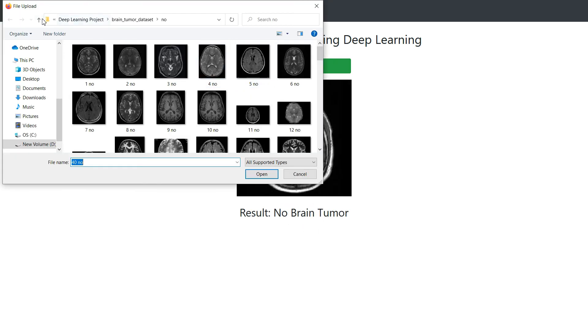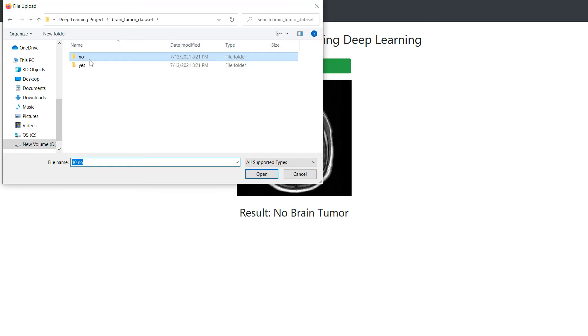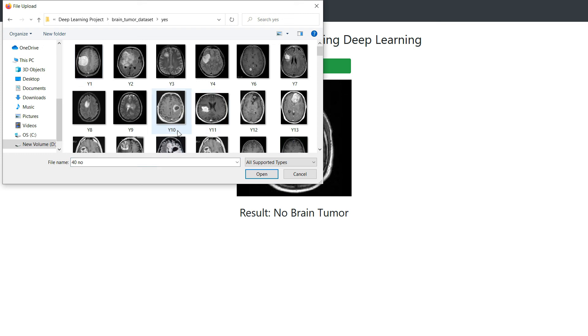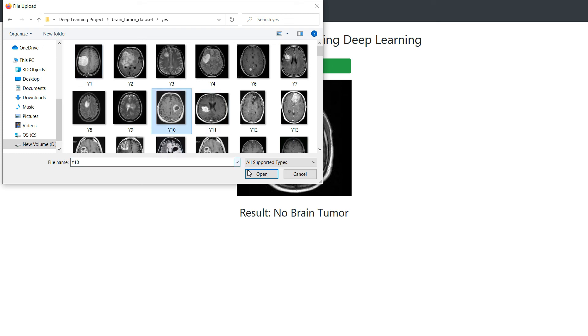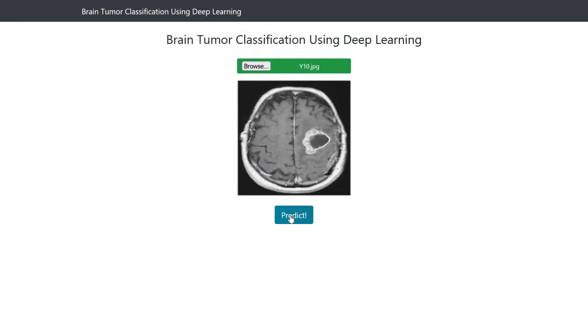Let's check for the positive case, so let's choose this one and click predict. You can see here: brain tumor detected.